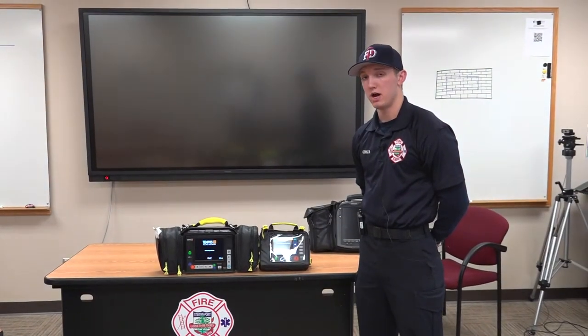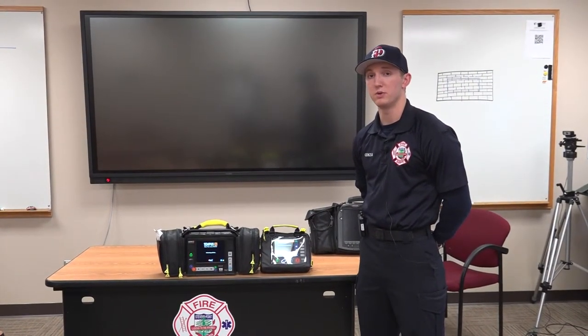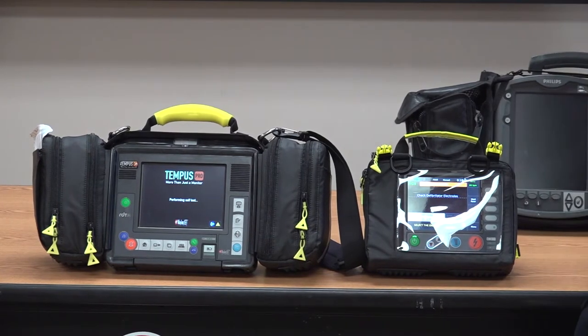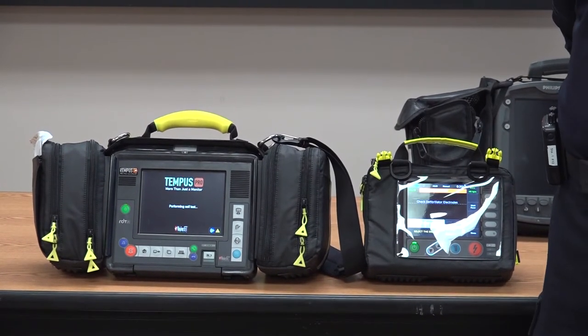These are military tech monitors. The military have been using them for quite some time now and they have just recently reached the United States. It has passed FDA clearance and is capable of being on ambulances.